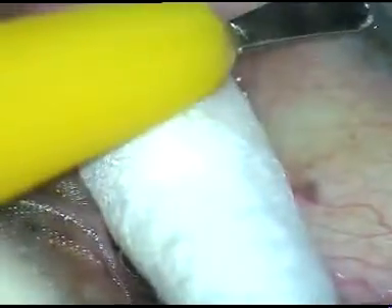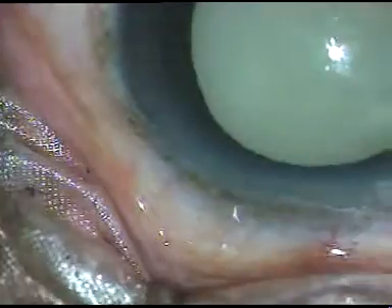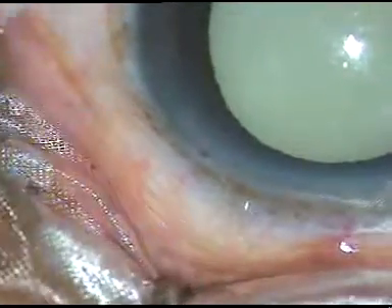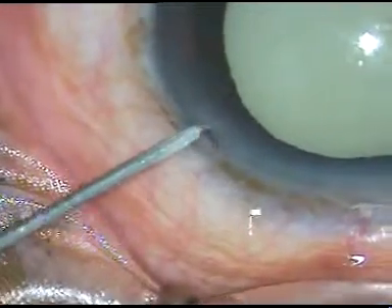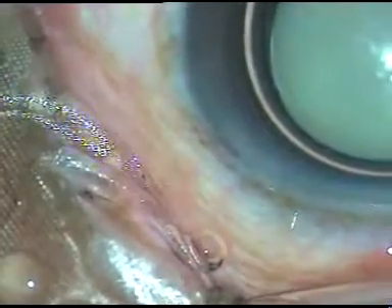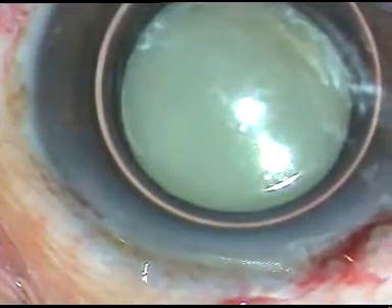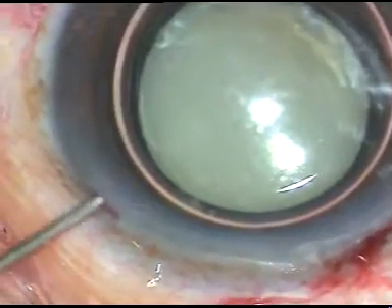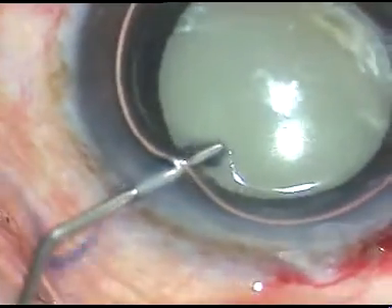Number 1: the intralenticular pressure is raised to some extent. Number 2: the zonule is weak. Number 3: the nucleus floats in the capsular bag and it is difficult to chop the nucleus without any epinuclear support.